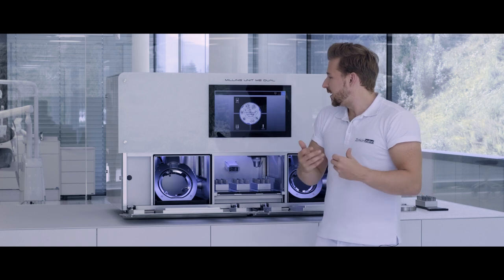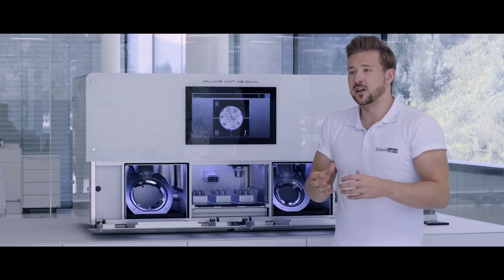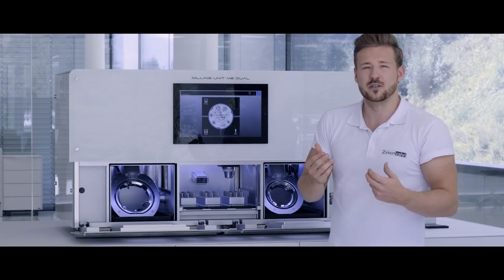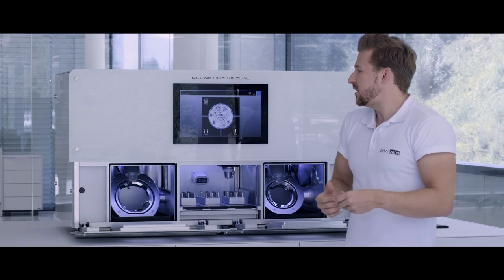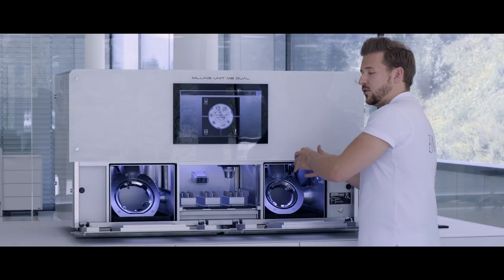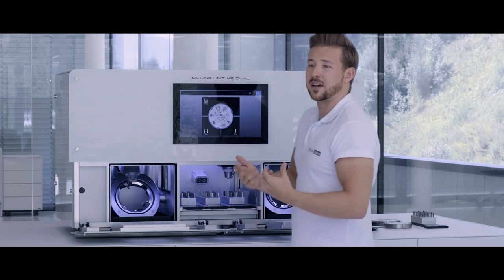What are the big advantages of this machine? As mentioned before, you can mill all future blank sizes. The machine is never blocked by just one job that has to be milled. You have the possibility to start and stop your milling process at any time. For example, if you have a very urgent temporary that you need to mill, you stop the milling process on the left side, put your temporary in on the right side, mill it, and then continue milling on the left side again.